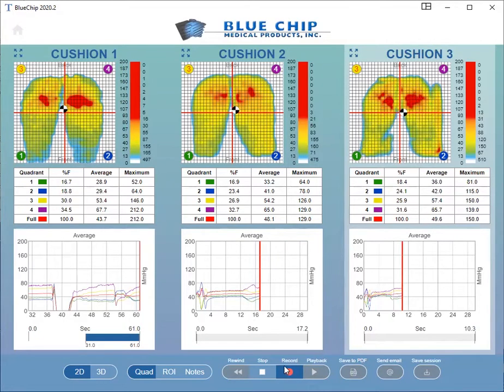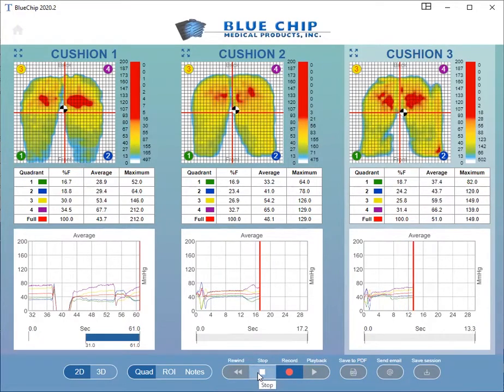By clicking on the Maximize Cushion View button at the top left, you can switch to the Single Cushion View.